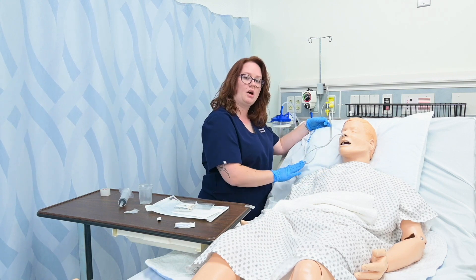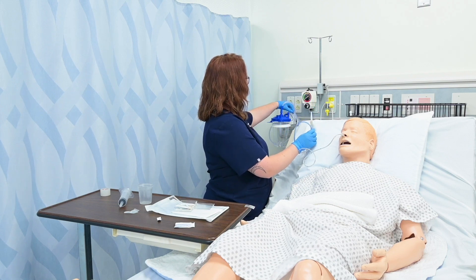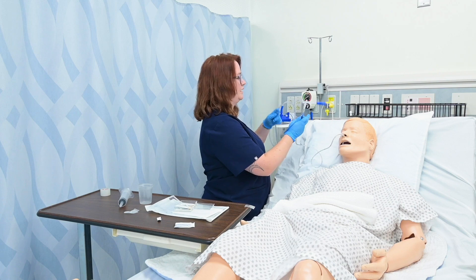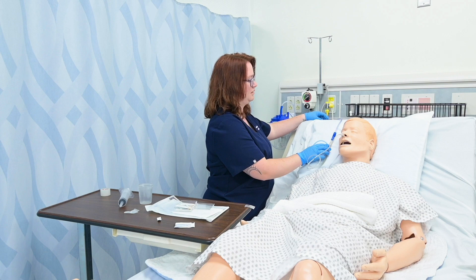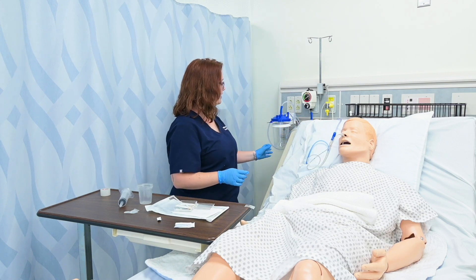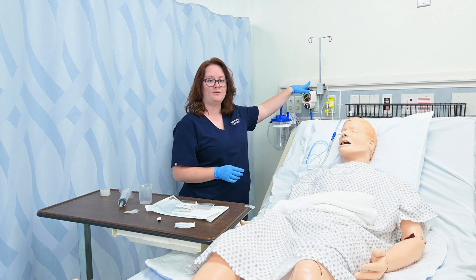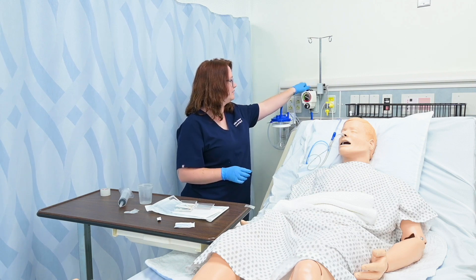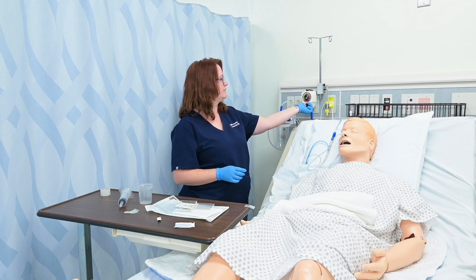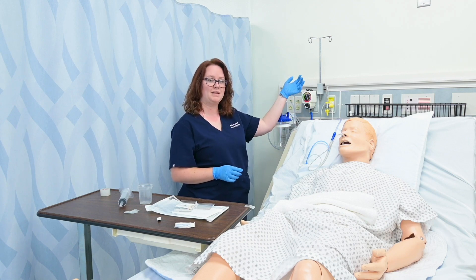I could also secure this portion to their gown so that it doesn't pull. This portion should always be above their stomach. Then I connect it to suction — if ordered, I simply plug this in to my suction tubing, which is connected to my suction canister. The suction canister is connected to the vacuum on the wall and I turn that on. I can use the dial to determine the suction level and set it for consistent or intermittent suctioning.